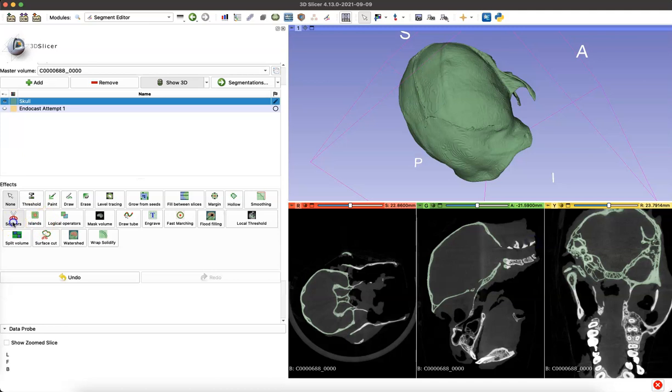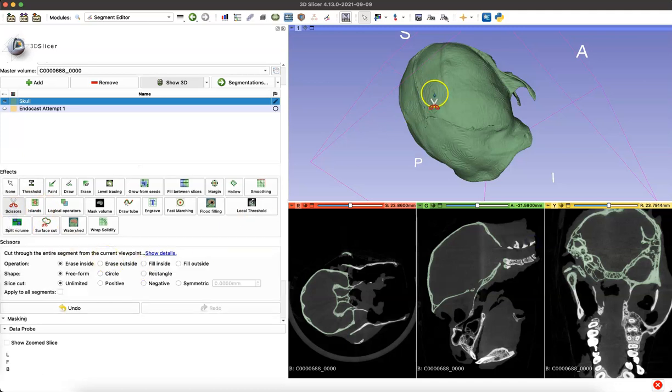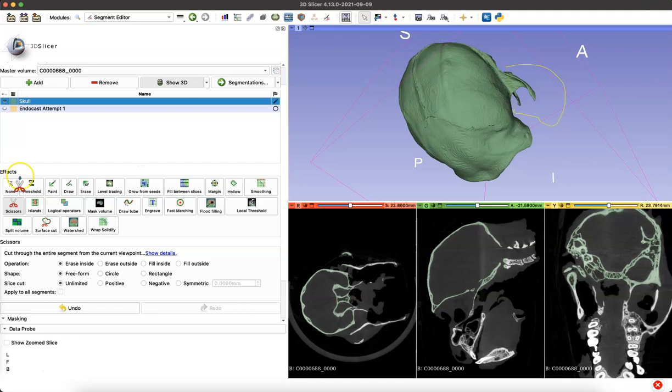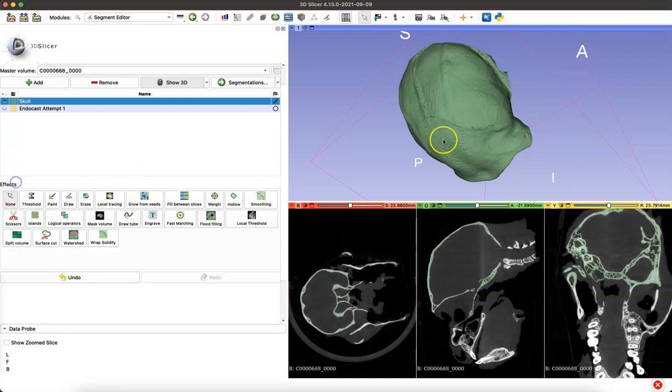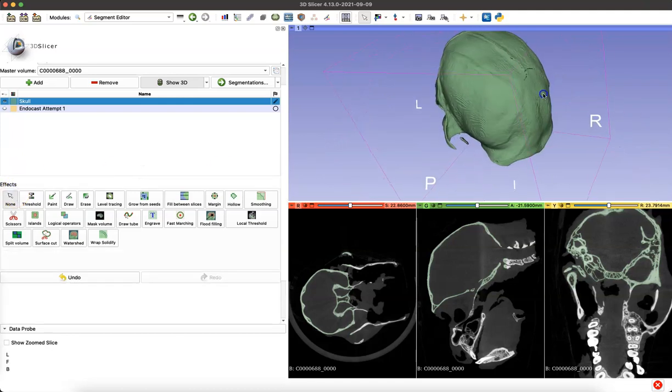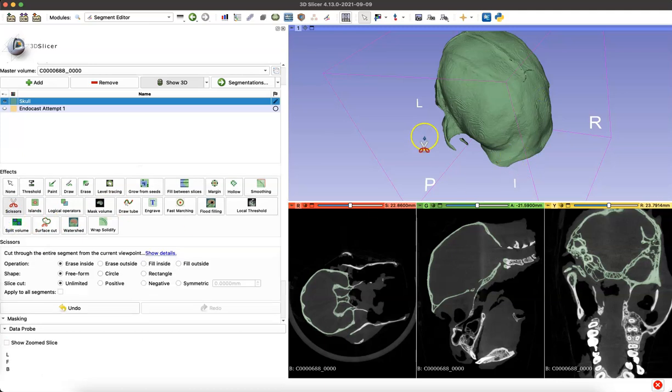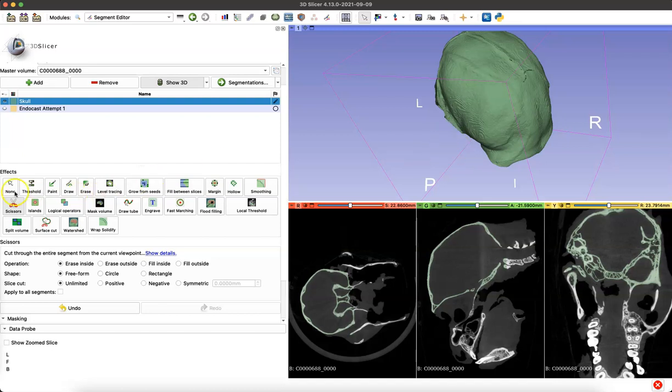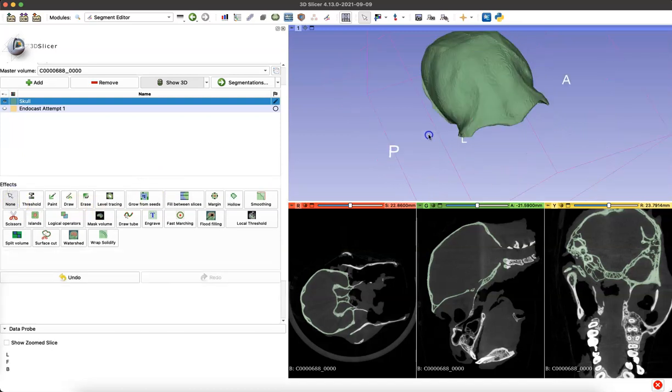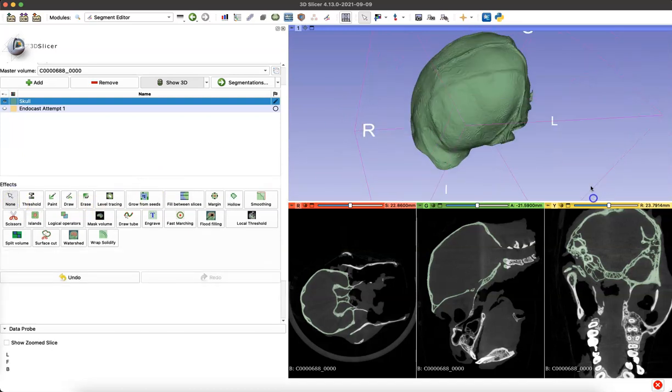I didn't accidentally cut a hole in the model that the program would then think that it needs to assess. So now next time we run WrapSolidify, basically what we've done is help the program to not get distracted by other information, the orbital cavities, the nasal cavities, any paranasal sinuses.